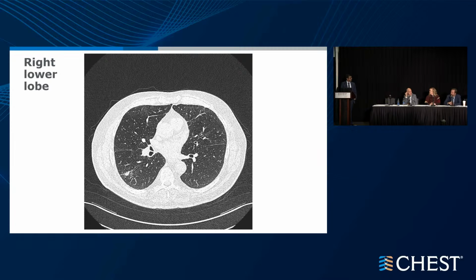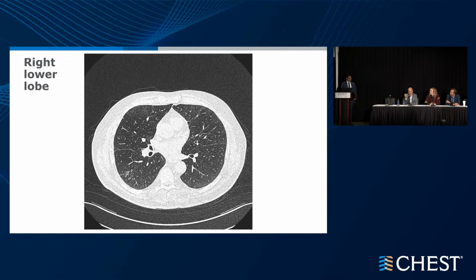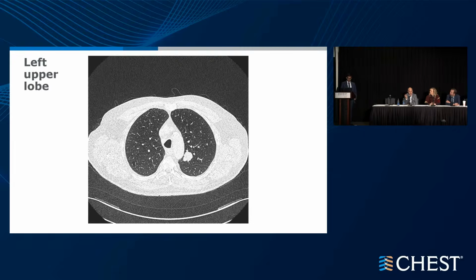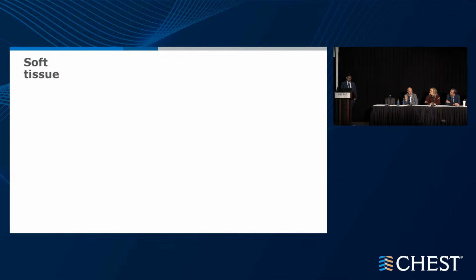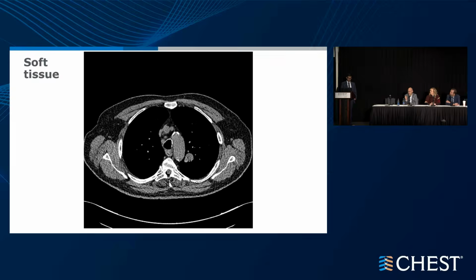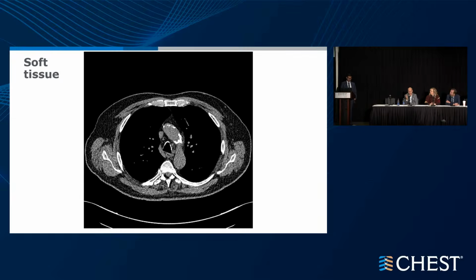Again, this is a different approach. What's beautiful about this is I don't think there is a clear way of doing it. We can just rationalize our approaches. Atelectasis, I think we're talking a lot about it, but the reality is I don't think it's that common as in the studies that you read, like iLocate or VESPA, because the settings are different.